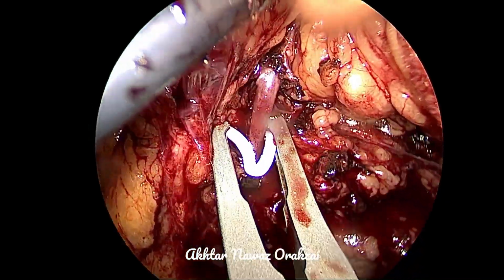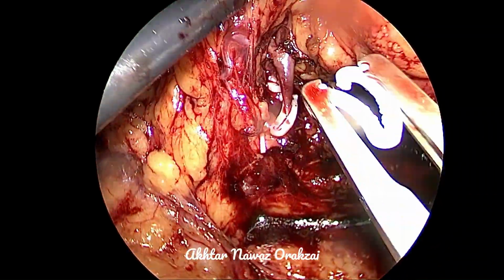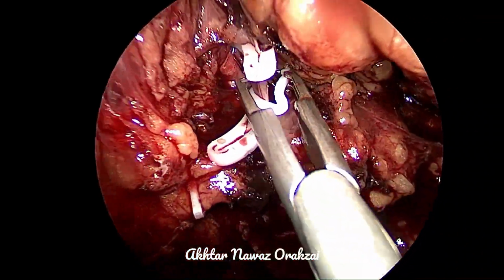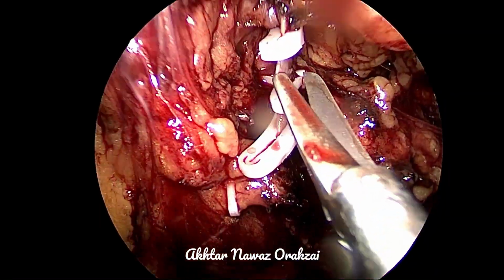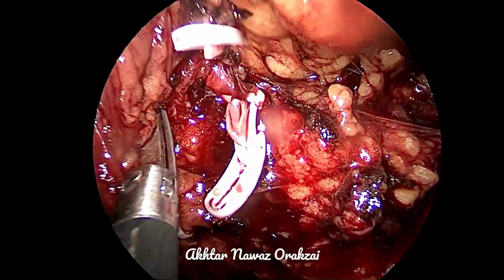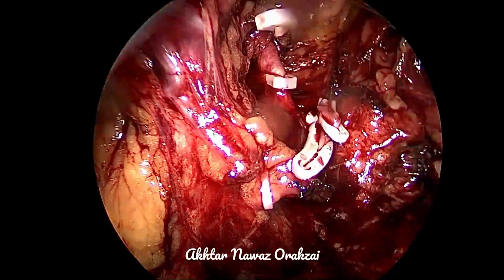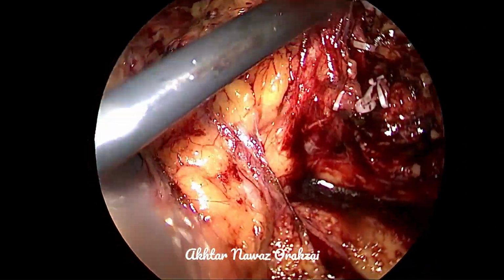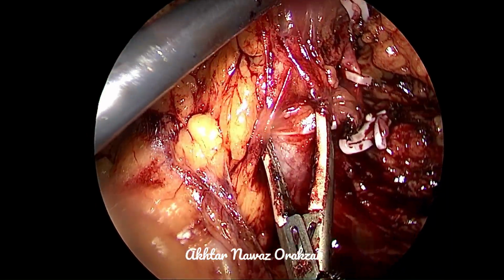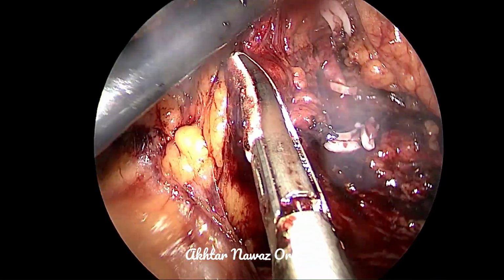So clip the artery first so that the vein becomes decompressed, then clip the vein, then cut the vein between the clips, then clip the artery again, and then clip and cut the main vein, and then do the artery. So one vein has been cut. Now we are proceeding towards the main renal vein.